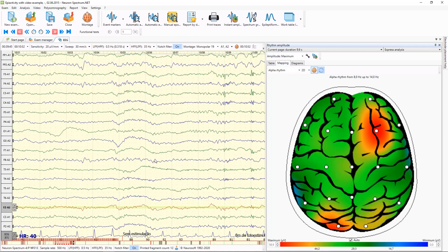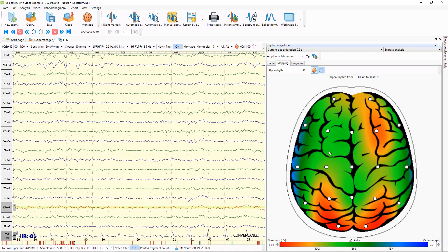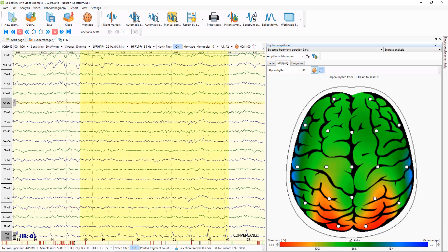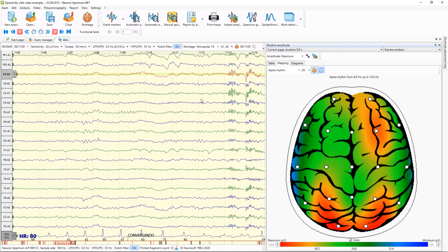You can see that when I scroll the traces, the analysis results are changing. This is because in this window, Express Analysis is working. It means that all you see on the left side will be analyzed on the right side. For example, if I select some part of the traces, you will see the selected fragment duration — 5.6 seconds. If there is no selection, it shows the current page duration — 10 seconds. When I move the traces, the analysis results change accordingly.